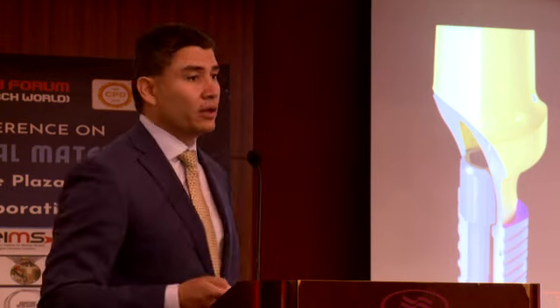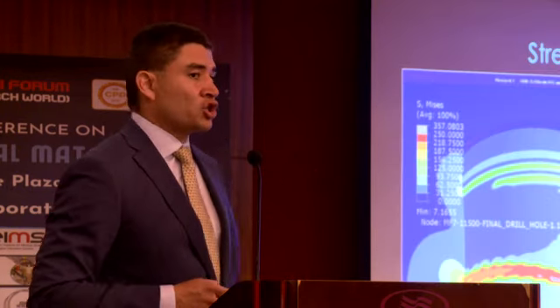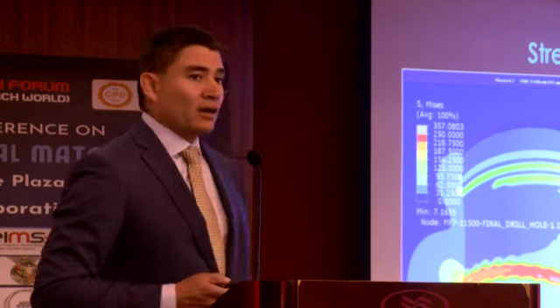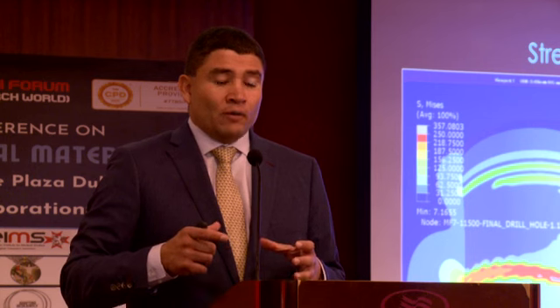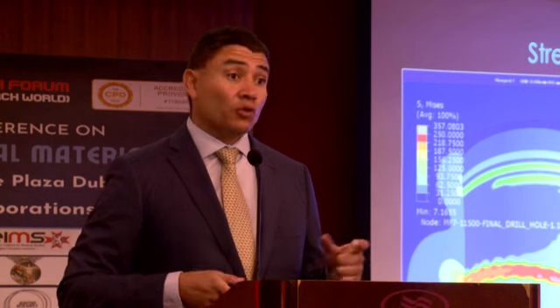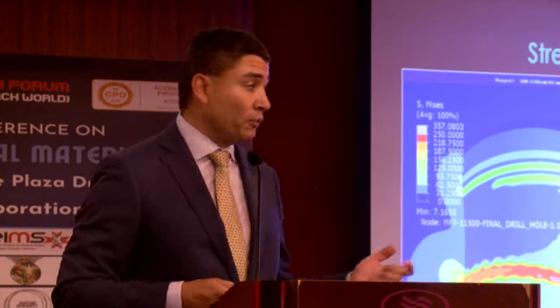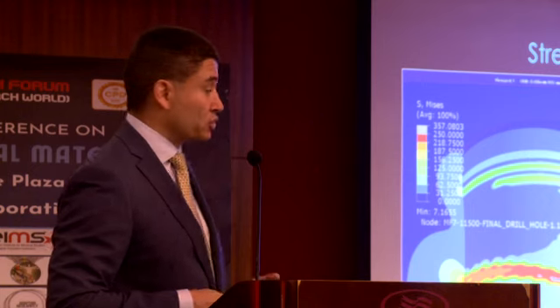So what about the stress reduction of the implant at the crest? What if I just overtorque my implant and the implant is super stable, but I put in a lot of pressure in the osteotomy that I created? Well, would that have a detrimental effect? Yeah, hell yeah, we will have that detrimental effect. So don't overtorque the implants, right? And we know that by studies that show that.